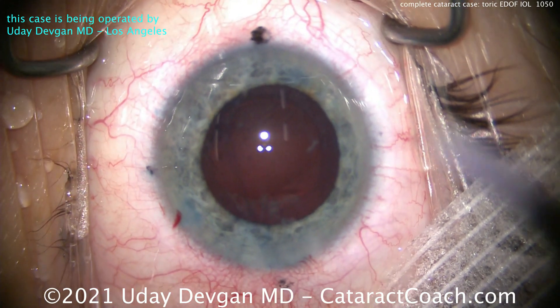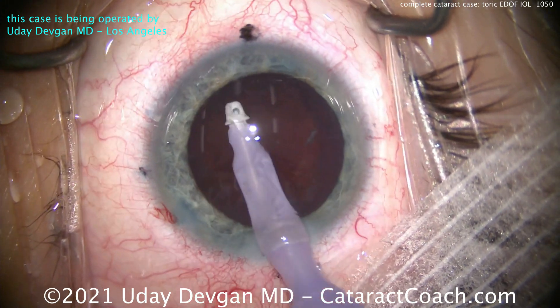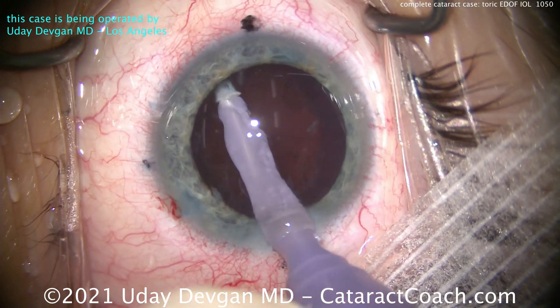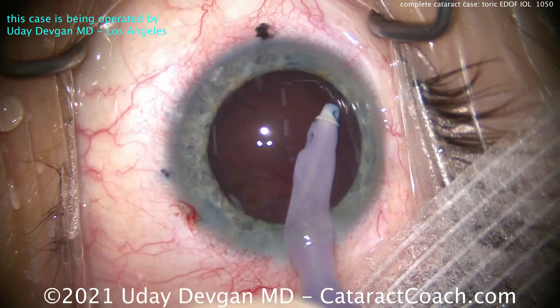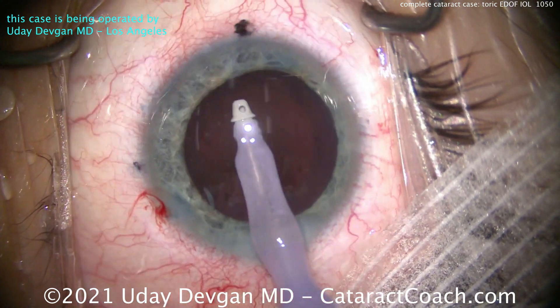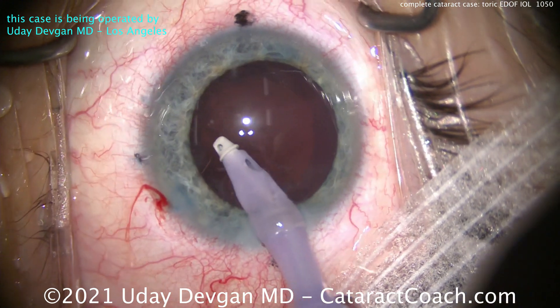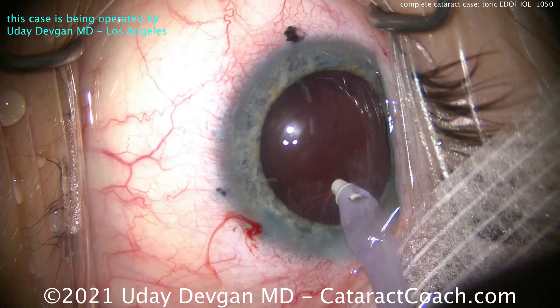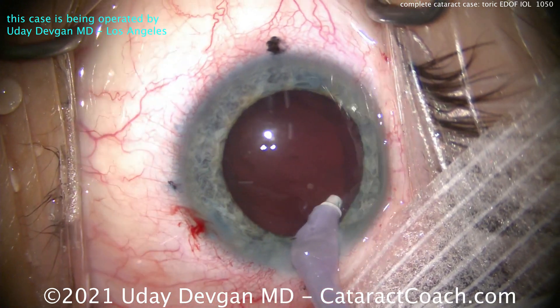Because the patient is primarily dependent on this left eye for all of his work, we wanted to choose a lens that's going to give him a really wide range of vision. In this situation that means an extended depth of focus lens, because it'll increase his effective depth of field. The patient is able to achieve great distance vision — just about 20/20 — but also able to do useful things at the intermediate zone.